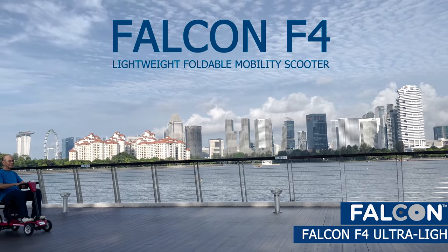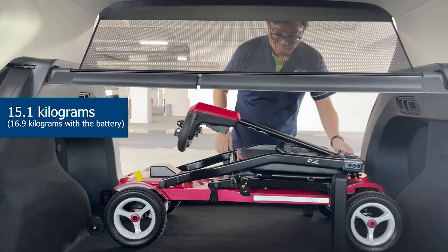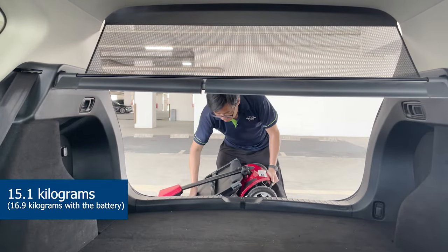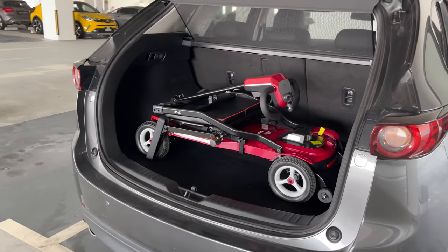Introducing the Falcon F4 Ultra Light Mobility Scooter, an extremely lightweight foldable mobility scooter. Weighing in at an astonishingly light 15.1kg, and 16.9kg with the battery.